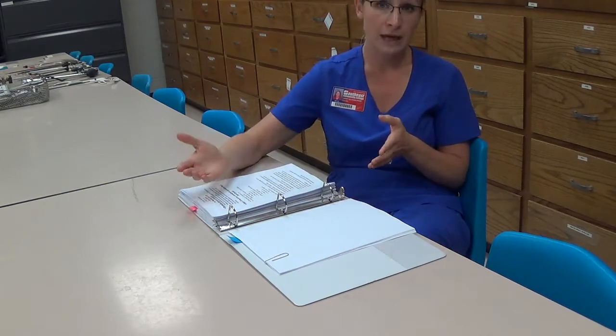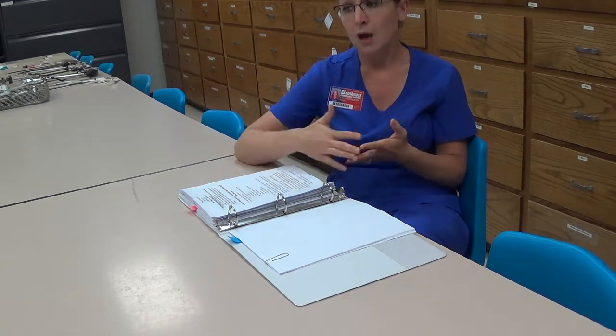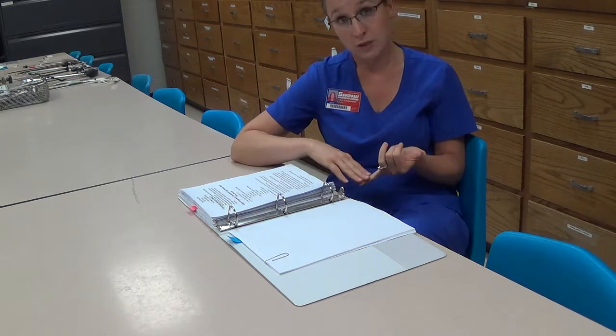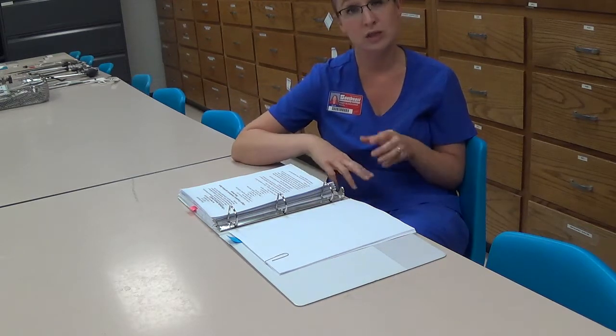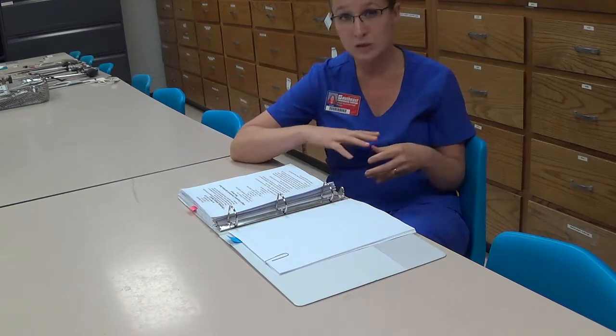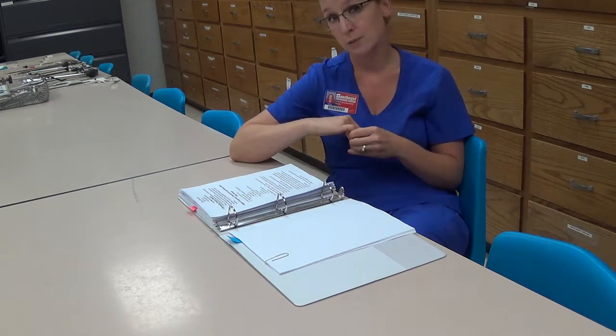After they get set up through the Mayo and cords, I demonstrate the whole second half of the competency assessment up through the closing count. This includes all accessory duties — loading the sponge stick, getting fluids on and properly labeling them — then gowning and gloving the surgeon, draping the patient with the laparotomy drape, pulling up and attaching cords, performing the timeout, handing the knife to the surgeon, and then the closing count, medication identification, five post-op duty identification, and beginning to discuss suture identification.